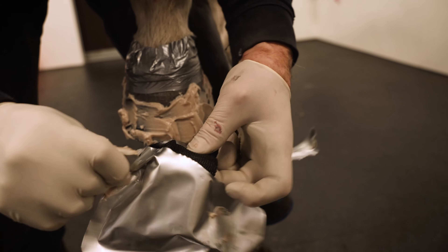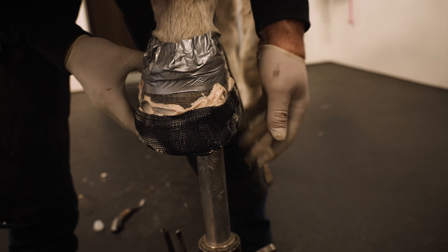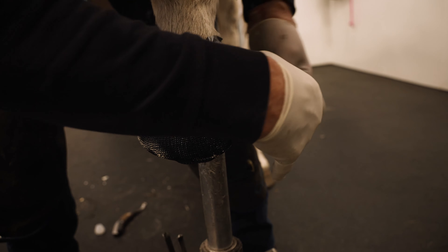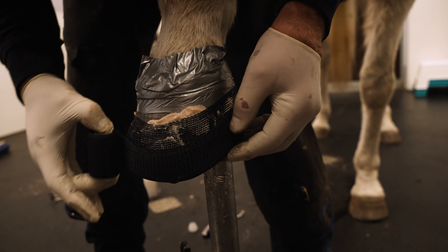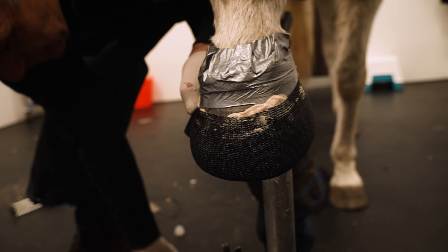Remove the Mustad HoofCast from its protective bag and wrap the hoof. Do not tape above the coronary band or the heel bulbs. Wrap the hoof between six to seven times — this will use up half the roll, allowing for two hooves per roll.